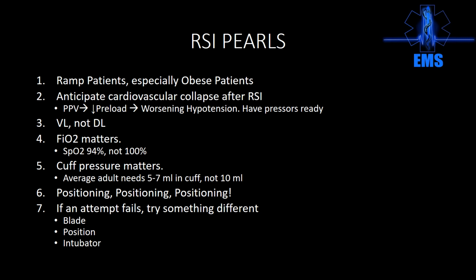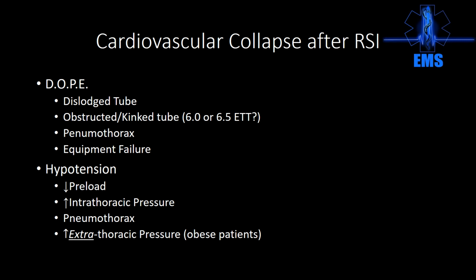There's all kinds of reasons that people miss airways. Some of it comes down to just mental frustration and not being able to concentrate. This is an extremely difficult task that takes years to master and has the potential to really hurt somebody. So we got to be smarter about this and work through the problem, and sometimes that just means getting a different technician in there to place the tube.